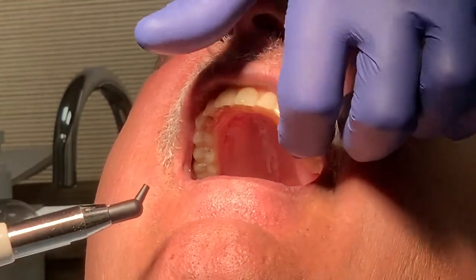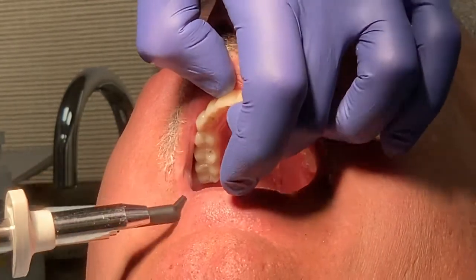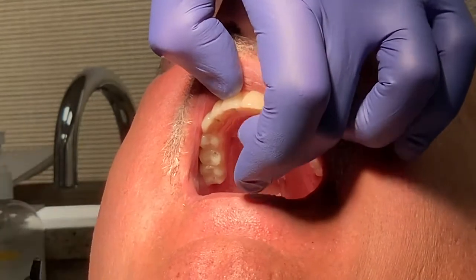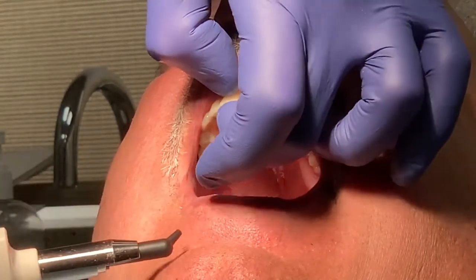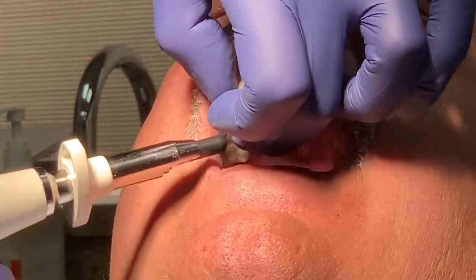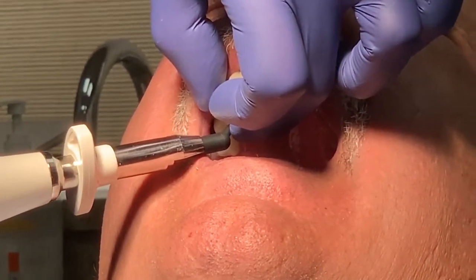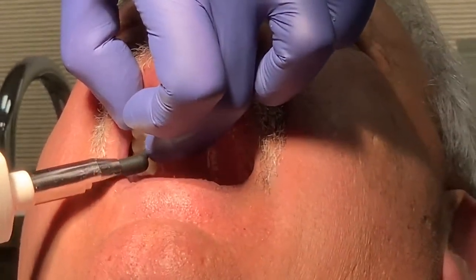So what is that again? That we put. This material is called Clip. It's a Voco product. It's an interim restorative material that's light cured, and it has the consistency of a gummy bear after you cure it. But it's easy to remove. You can pick it out generally with a scaler.